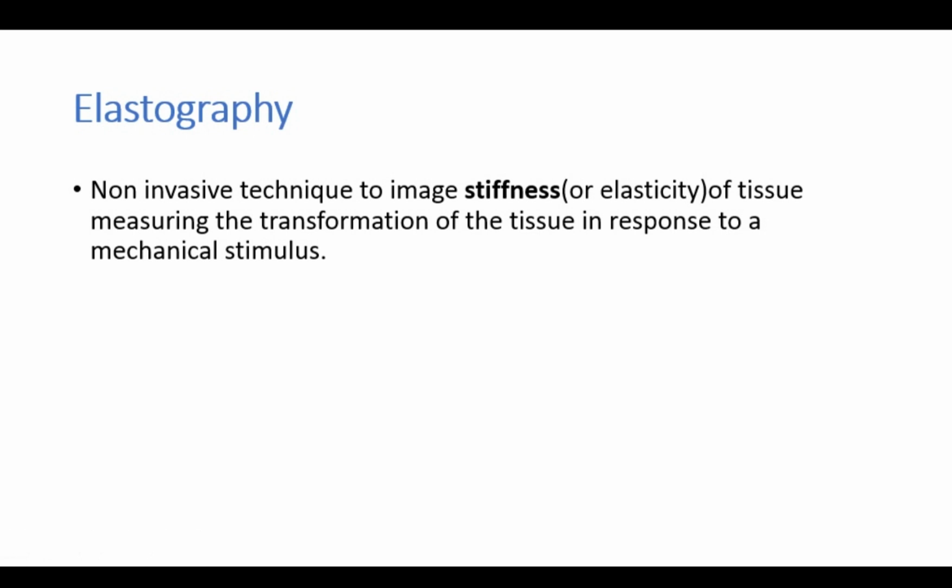So, elastography. What is elastography? It's a new technique added to imaging in the last decades. It is a non-invasive technique to image the stiffness and elasticity of the tissue, measuring the deformation of the tissue in response to an external stimulus.